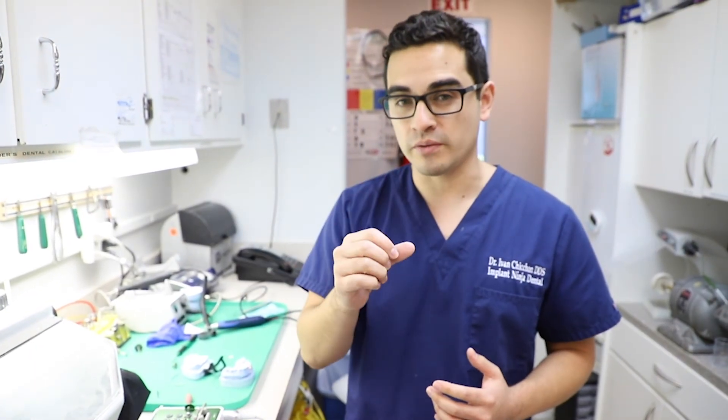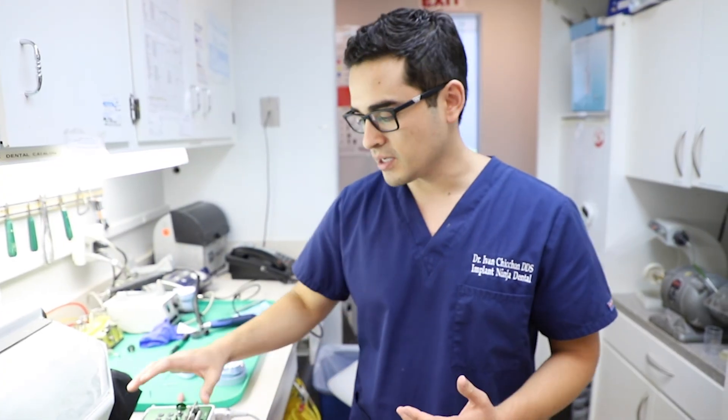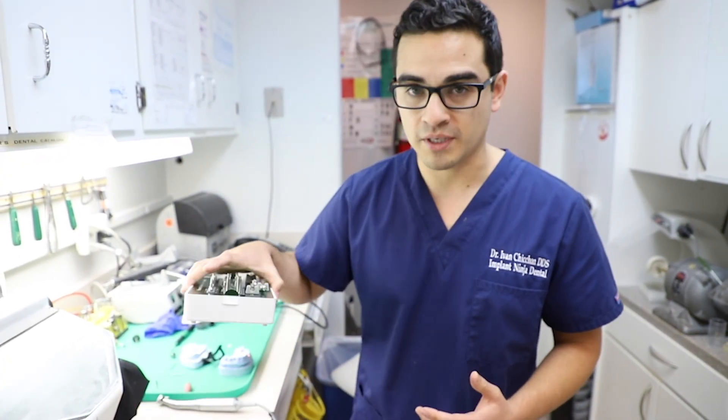Just in case you don't have a screw removal kit, another thing you can do is take a little quarter round burr — the smallest burr you can find — and just make a little slot on the screw head, then stick a flat end implant driver and back it out. If you make the slot wide enough, you'll be able to catch it and back that screw out. But the easiest way by far is using one of these screw removal kits.